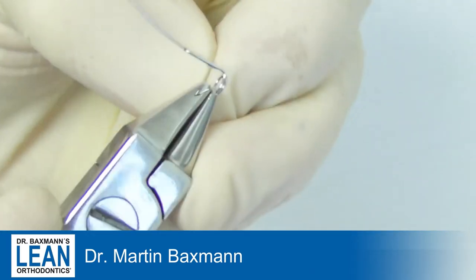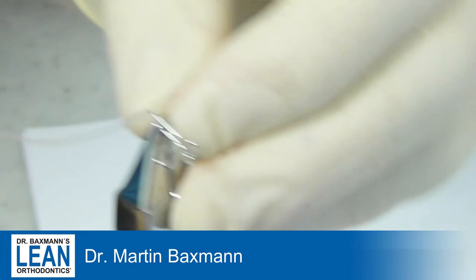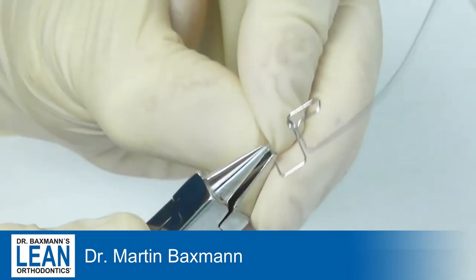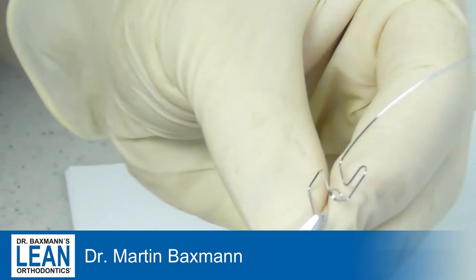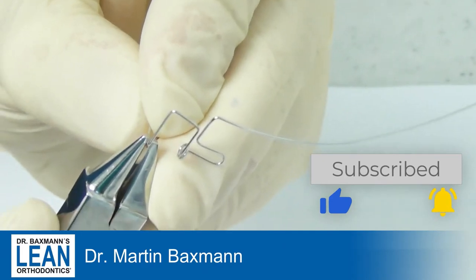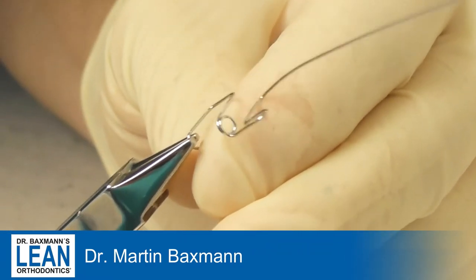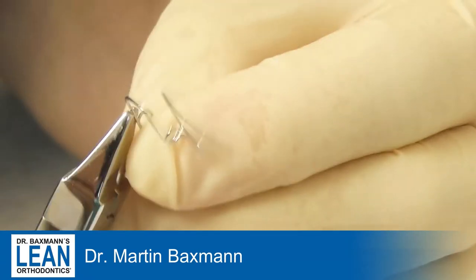As you can see, we start with a T-loop type of bend and now we have a double helix that will bring the tooth to the outside. We need some extra space to attach the canine to the wire — that's what the middle part is for, where the wire goes in the slot of the bracket. We then add another double helix and go to the other side to complete the T-loop on the other side as well.